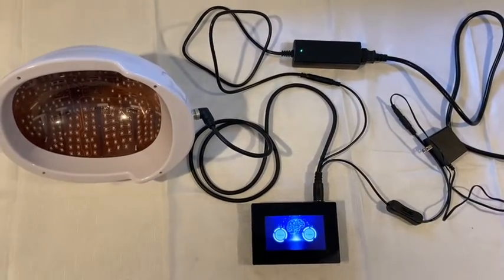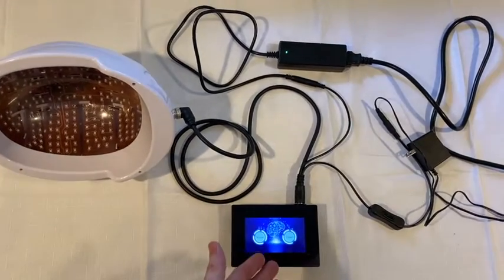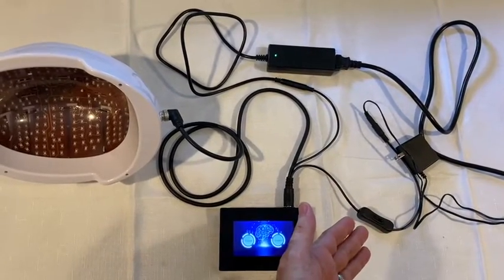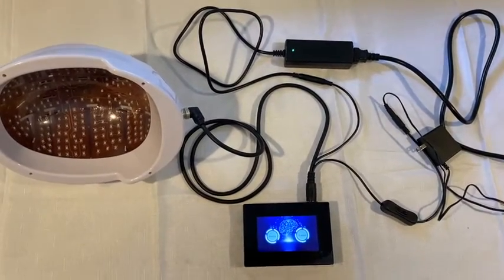Now I have attached the right angle to the back of the helmet, the straight DIN into the controller, the small power supply into the cord with the switch, and the large power supply into the cord without a switch, and power is on.